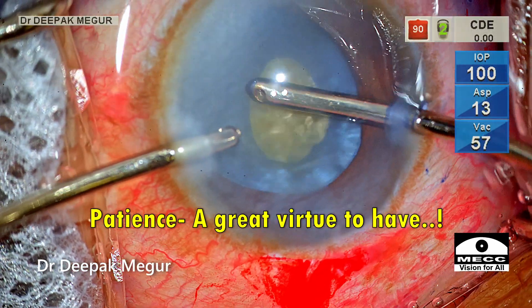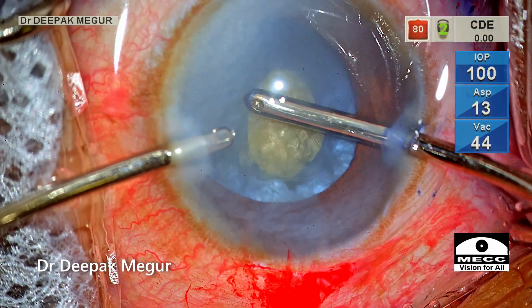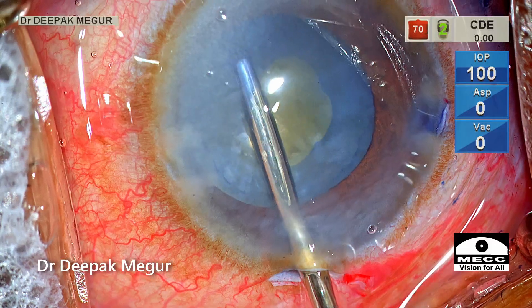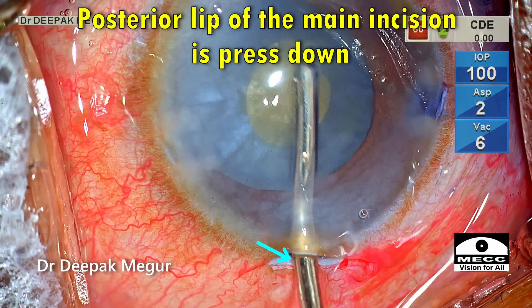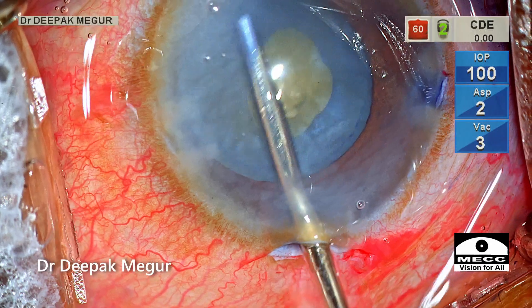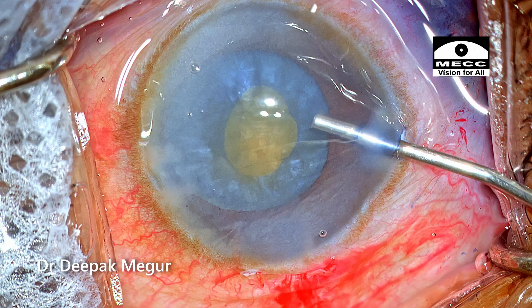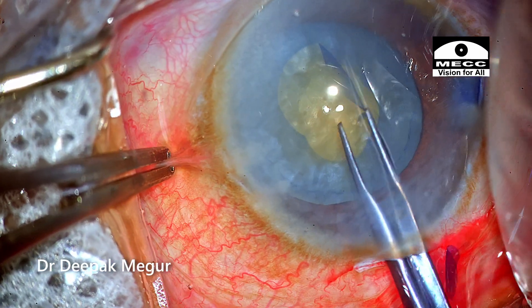Patience plays a great role in managing this — you just have to keep tapping at the nucleus and all the cortex eventually comes out, substantially decompressing the bag. I'm going in with my irrigation probe alone through the main incision, irrigating loose cortex and tapping the lens. It's important during this maneuver to press down the posterior lip of the main incision to avoid any build-up of pressure. Once sufficient decompression has been achieved, I proceed to enlarge the rhexis. A tangential cut using micro scissors is given and a secondary large rhexis measuring about 5 mm is successfully created.